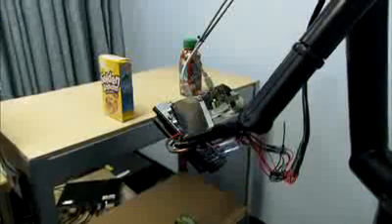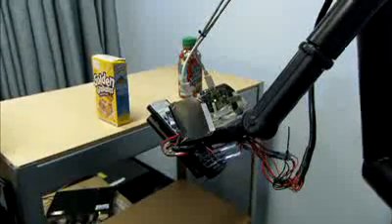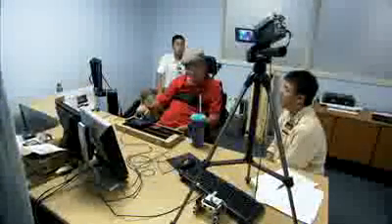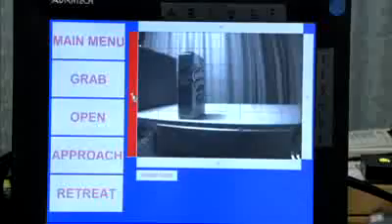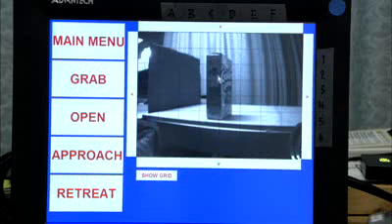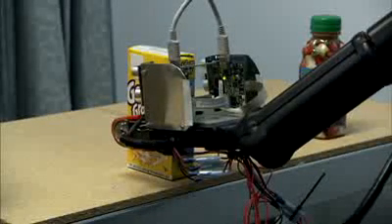A high-tech robotic arm may be the helping hand that patients with spinal cord injuries need to make their lives more independent. The rehab team at the Orlando Health Rehabilitation Institute and the Assistive Robotics Laboratory team at the University of Central Florida are evaluating technology developed by the university to operate the robotic arm. It's a device that will help, we're hoping, patients with spinal cord injuries, in particular those with spinal cord injuries in the neck, to be more independent.